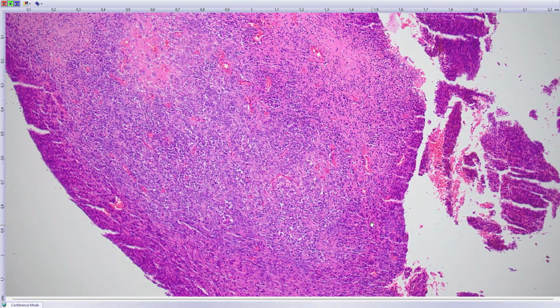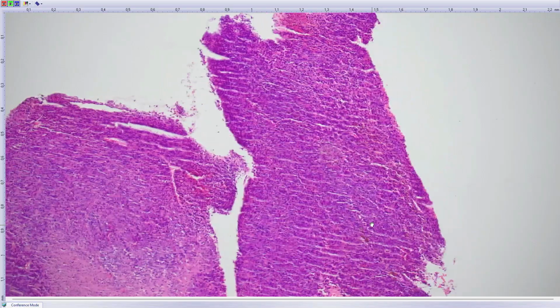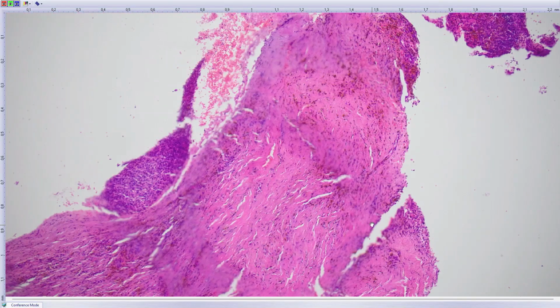Despite the name, these tumors have nothing in common with normal fibrous histiocytomas. They are different genetically, and they are considered low-grade sarcomas because they may metastasize to regional lymph nodes, or occasionally, in very few, like 1-2% of cases, may give rise to distant metastasis, but still almost all patients survive.